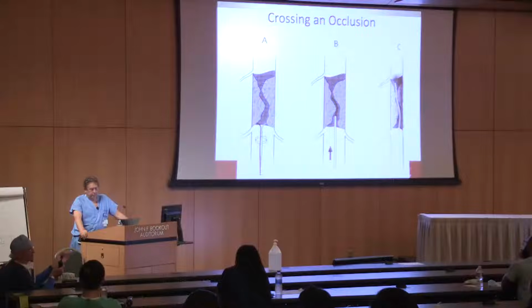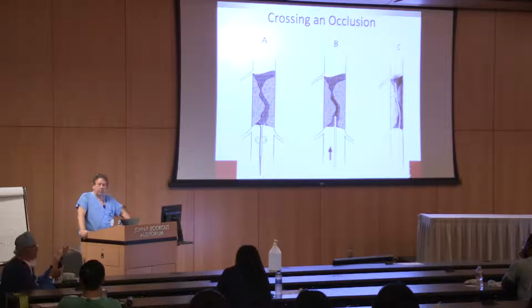What's the disadvantage of that instead of putting a longer sheath in? Or what's the disadvantage of putting a longer sheath? Why would people do that? Why would you just go ahead and balloon it from a left common iliac access, and you're ballooning, let's say, the right external iliac or the right distal common iliac?